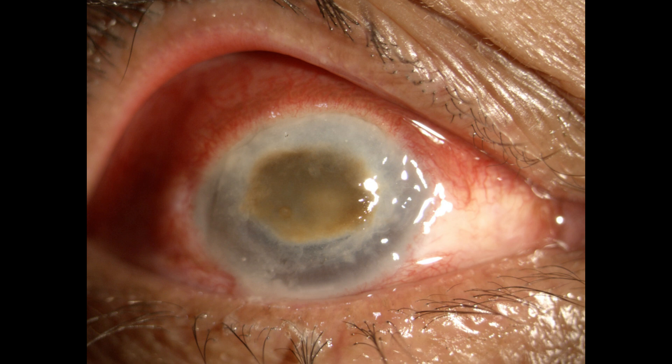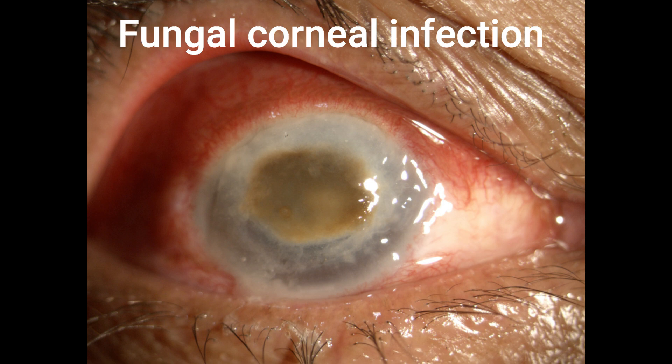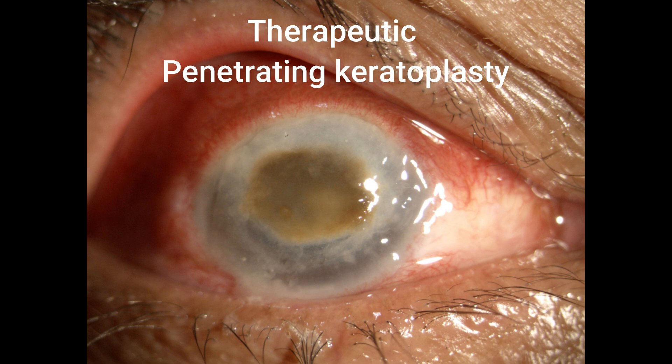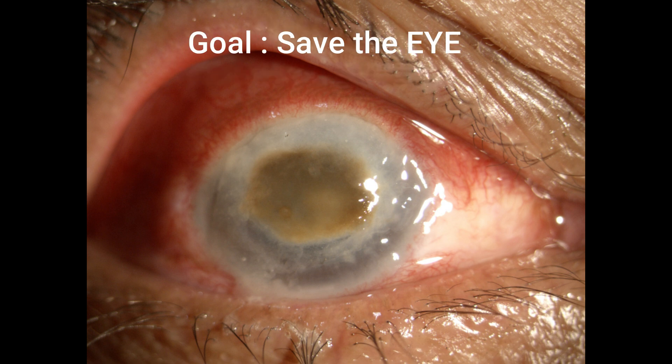In this video, we are demonstrating a therapeutic penetrating keratoplasty to remove a seriously infected cornea. Here you can see a proven fungal corneal infection with pigmented corneal infiltrates with extensive corneal involvement extending beyond the limbus. This infection has not responded to maximum medical therapy. Hence, we have resorted to therapeutic penetrating keratoplasty as the next step. Our main goal here is to save the eye itself, with improving vision as a secondary priority.